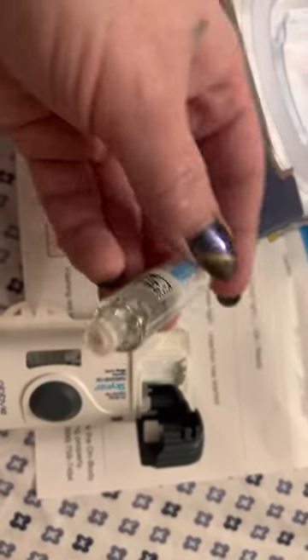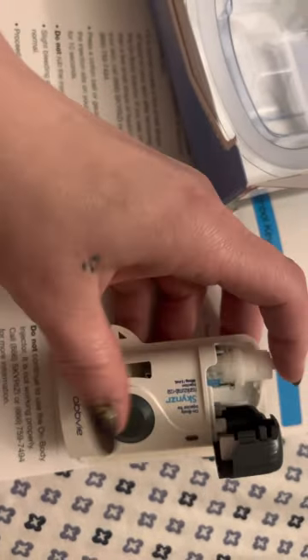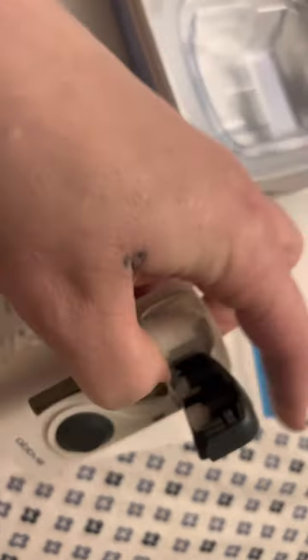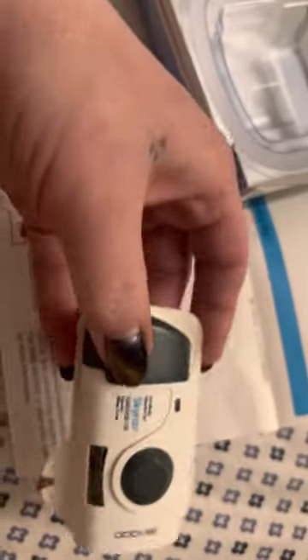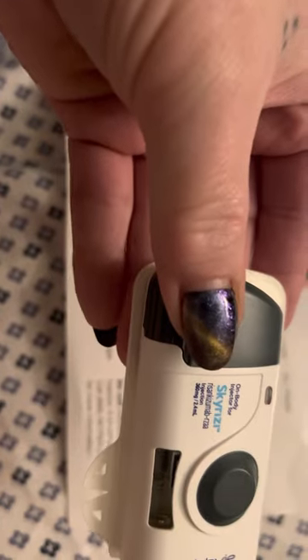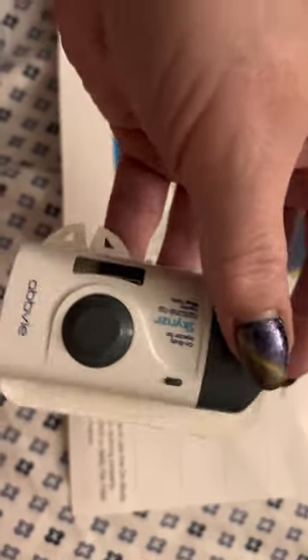That end goes down into the cartridge like so, and you're just going to push — push that in. Then this door is going to close. If you hear that little click, that means that it's closed.